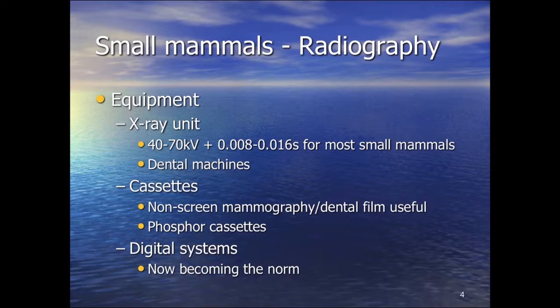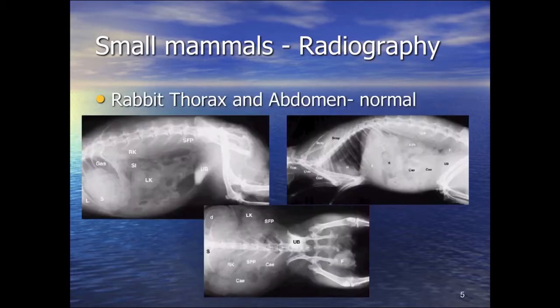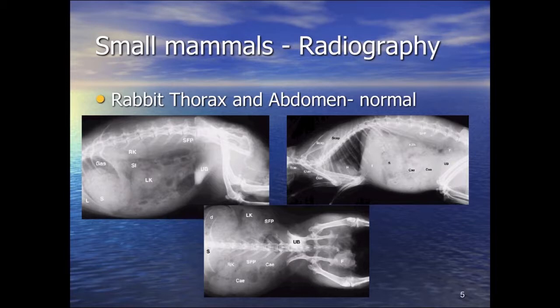These images are a mix of plain film traditional and digital to give you a typical view of normal rabbits — some of it is normal and some of it is not. These images have a lot of physical features. In fat bunnies you can usually see the kidney shadows pretty easily. The stomach should always have food in it — this one actually has quite a significant gas crescent and is somewhat distended. This particular bunny does have a little bit of ileus.